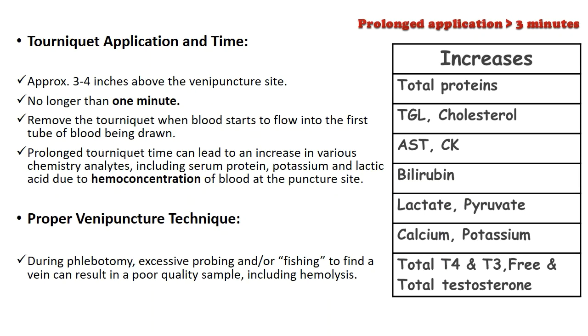Tourniquet application time. The tourniquet should not be tied more than 1 minute.